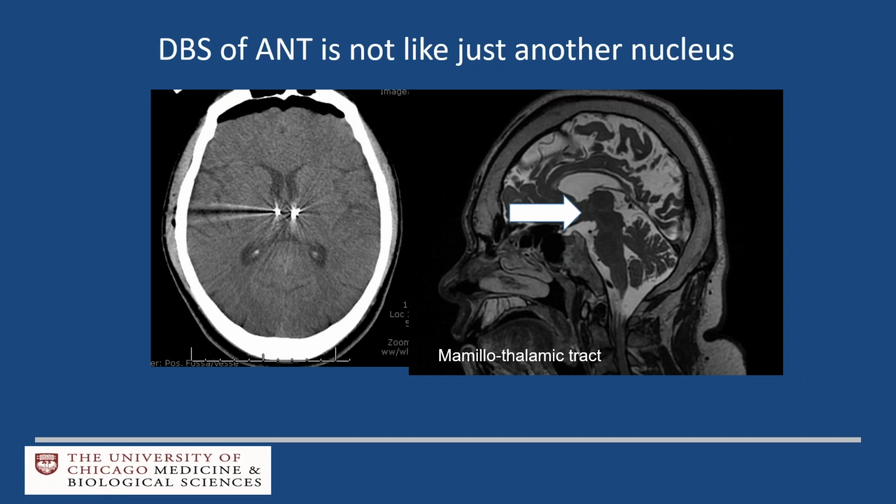That brings us to the next topic. This is still epilepsy, but it is DBS, and this is very critical; I would never do this without intra-op CT. This is an anterior nucleus of thalamus depth electrode implantation for epilepsy treatment. As you know, the original trial, the SANTE trial, because you have to use a transventricular access, showed that about 10% of the electrodes, because they are not that rigid, deviate from the target, which is excessively small due to going through the ependyma twice.